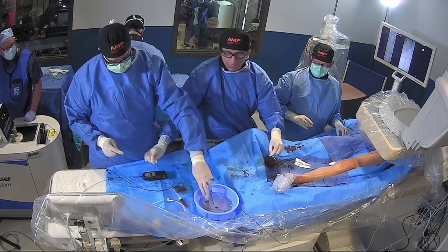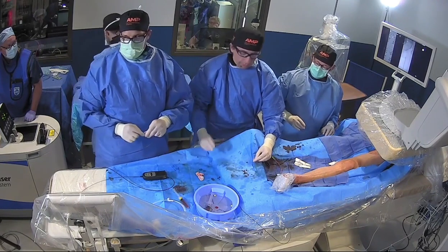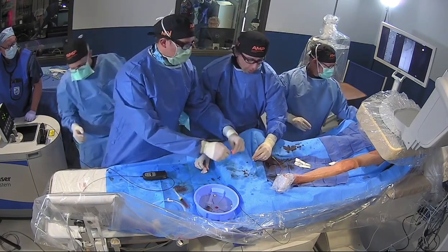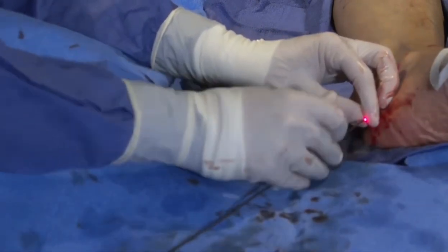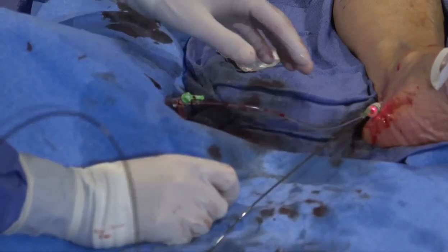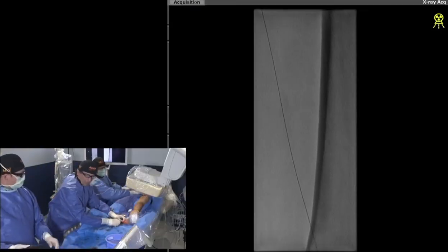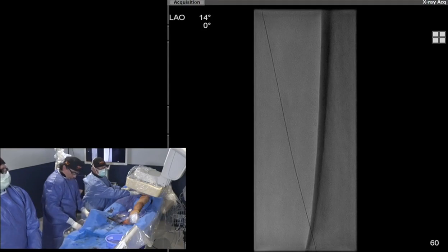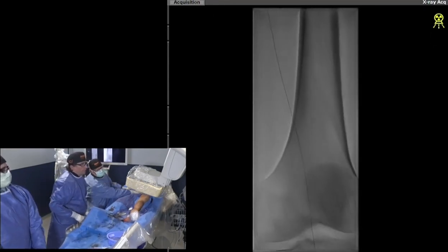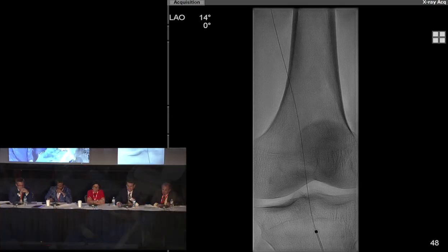I confirmed bleeding from the sheath and from the antegrade sheath. I chose the Turbo Power 2.0 laser for two reasons: because I'm delivering therapy in a retrograde fashion, the rotational feature makes it easy to advance. In the popliteal I won't rotate because it's smaller, but I will in the SFA. We have saline running through the antegrade small sheath and are delivering therapy retrograde. Laser won't photo-oblate any quicker than a millimeter per second — that's the best we can hope for, so he needs to go slow.